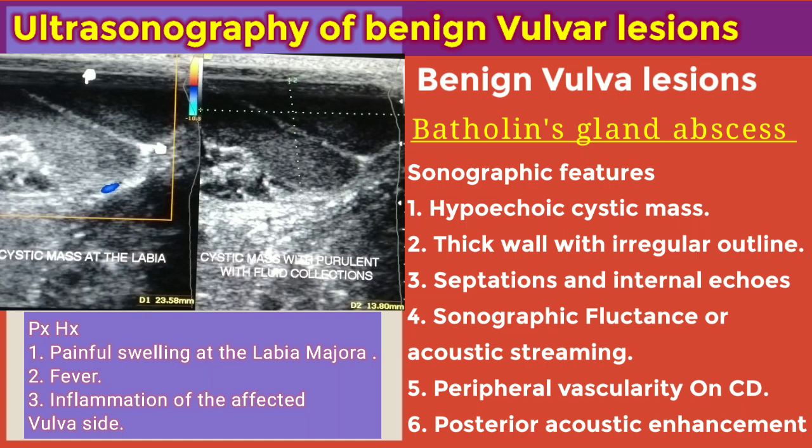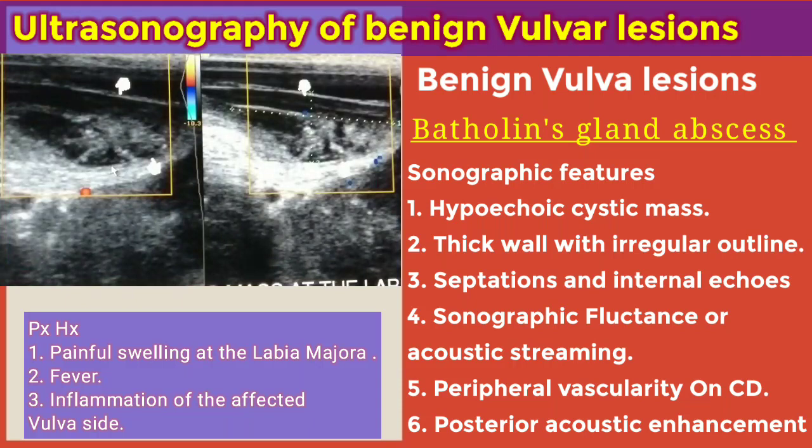The sonographic features of Bartholin's gland abscess include a hypoechoic mass — as we can see on the screen — with thick walls. The arrows are pointing at the septations. There will be an irregular outline and internal echoes, as well as presence of sonographic fluctuance or acoustic streaming, that is, movement of the purulent fluid collections seen within the Bartholin's gland abscess.